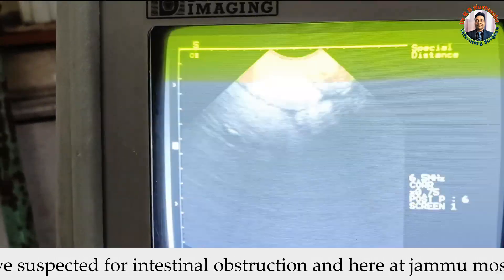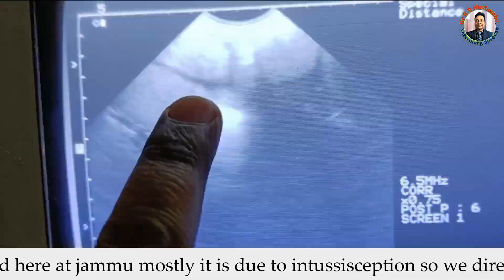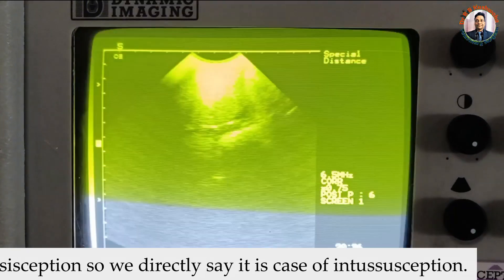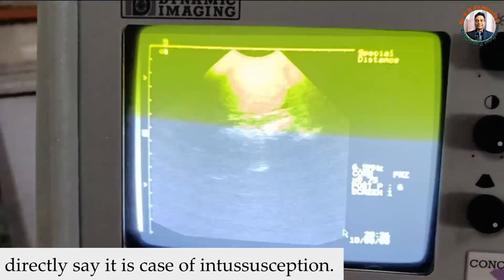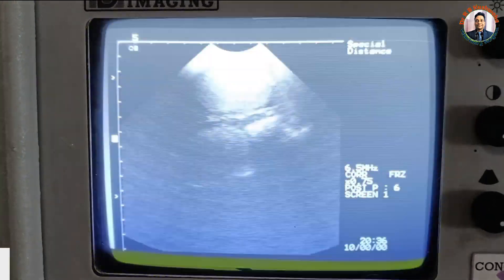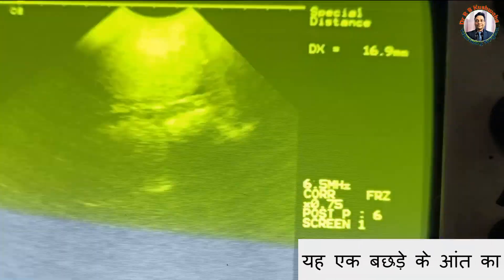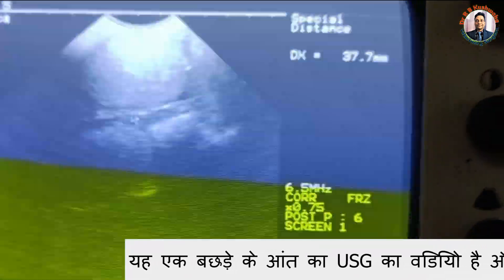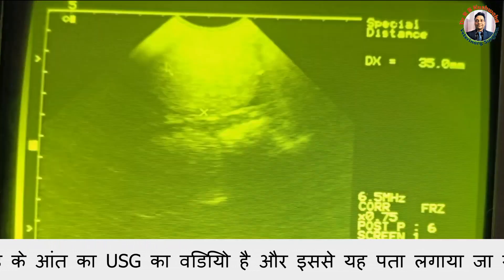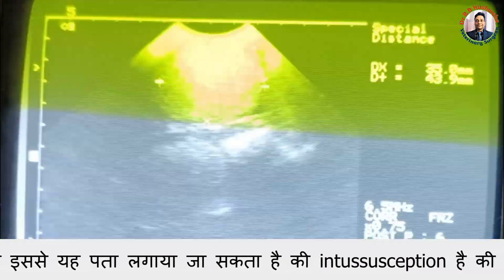You can see there is passive flow of ingesta in the intestine. This is the lumen of the intestine, and we can also measure the diameter of the intestine. The measurement is 36.3 mm, which means this is definitely a case of intestinal obstruction, and since the obstruction is here, it is most likely intussusception.